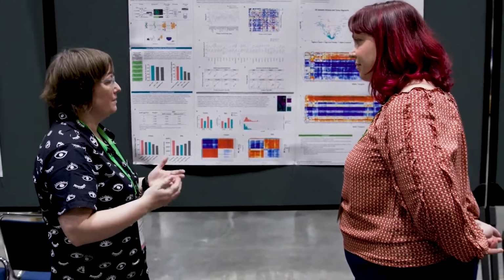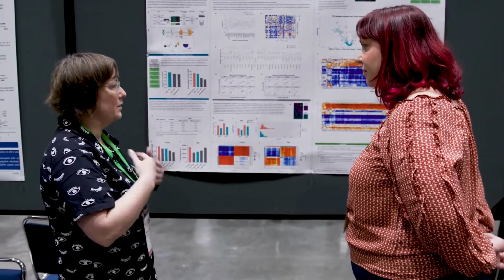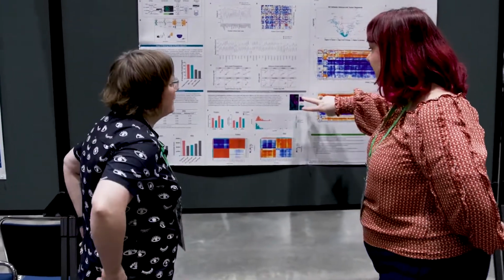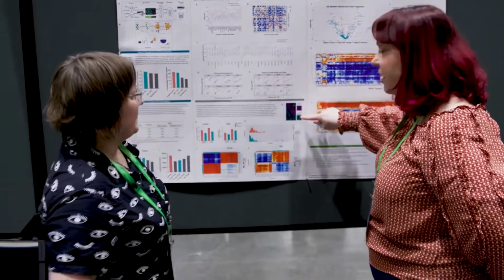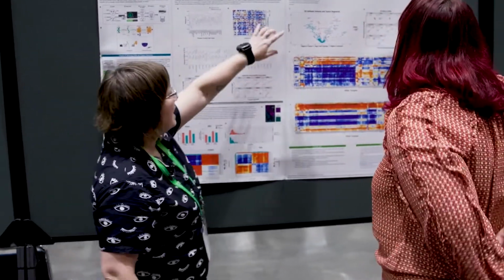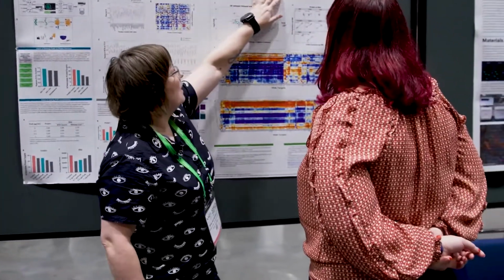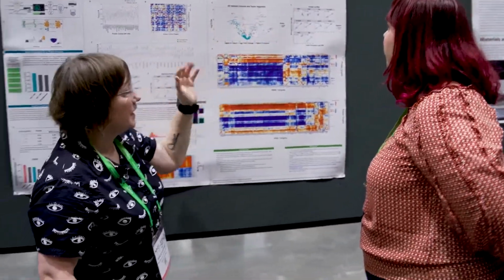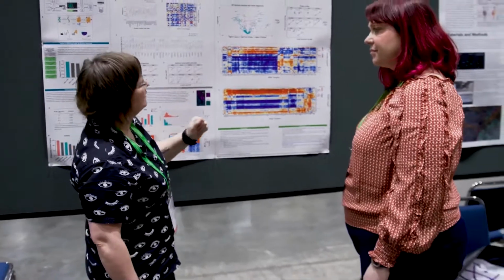It's just whatever you set your threshold at, and we're very stringent. And it looks like we did segmentation between the immune and the tumor. Yeah, so we did that with colorectal cancer. So this is where we masked and collected for our tumor, which is green.